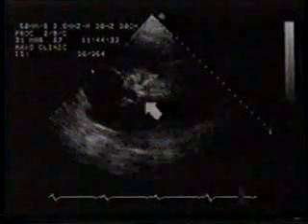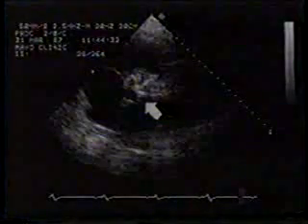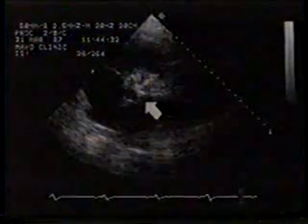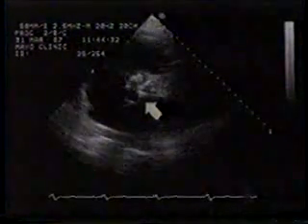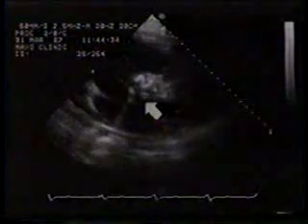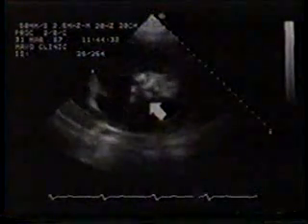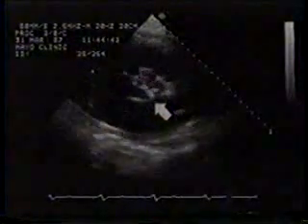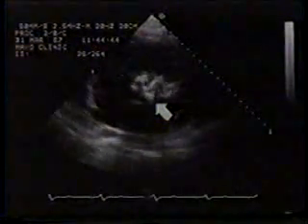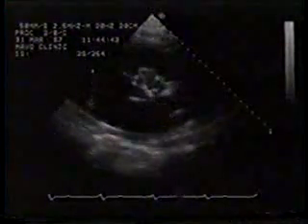This is a heavily calcified aortic valve in short axis. Often, as in this case, the degree of calcification obscures the valvular architecture. The valve clearly demonstrates reduced mobility, but scanning the valve fails to reveal an orifice that can be traced. 2D echo alone is not sufficient for confidently determining the severity of stenosis.